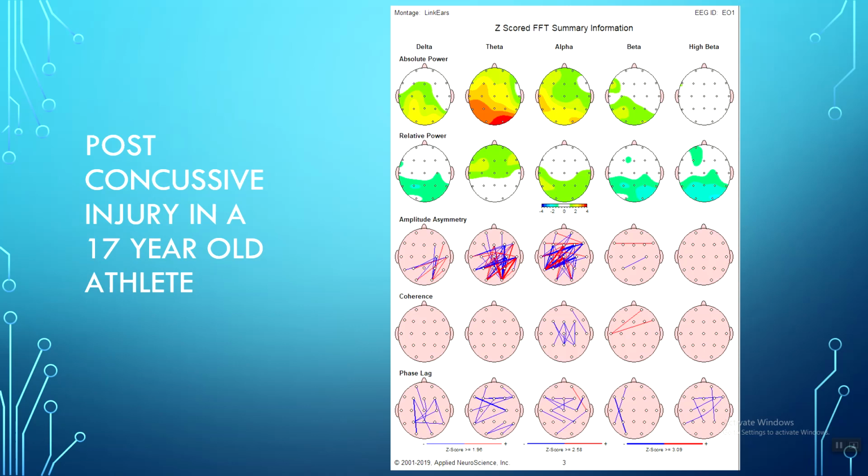I've explained the one that's the most noticeable with the naked eye, but sedatives and hypnotics will largely slow the person down. And when I say slow the person down, it will slow down their peak frequency, but it will also increase the amplitude of slow waves. A stimulant, like an Adderall or a Vyvanse or anything like that, will generally enhance the amount of fast frequencies.